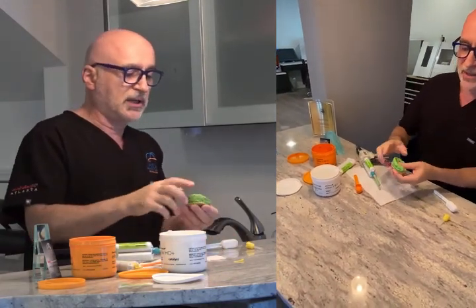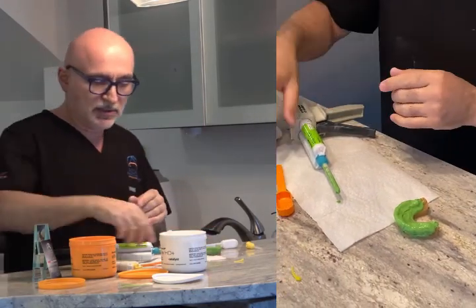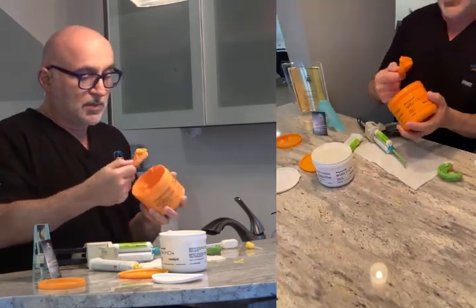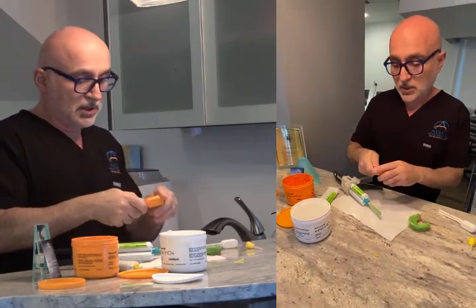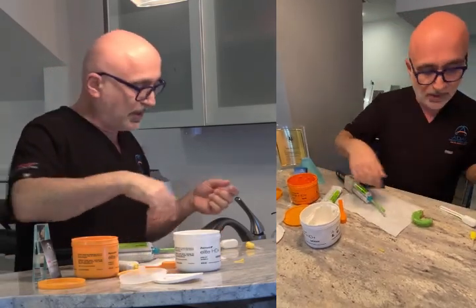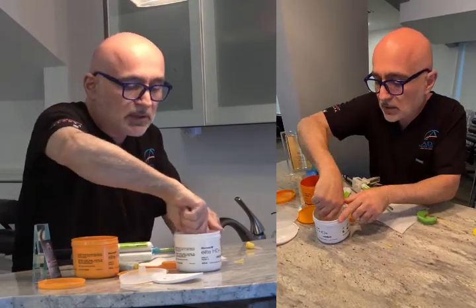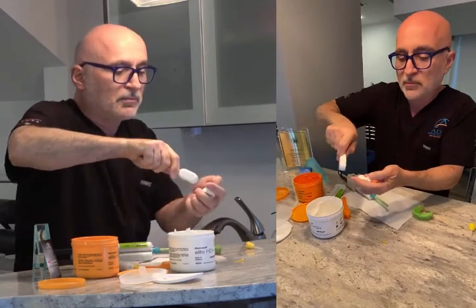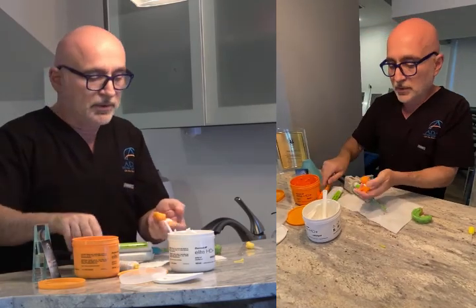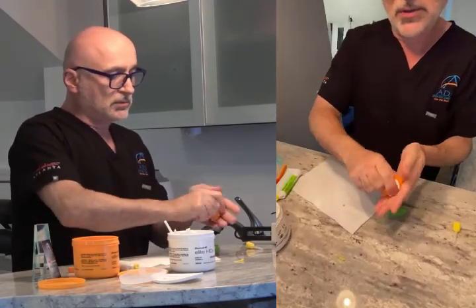The light body is set — you can see it's not tacky. I don't peel it off; I keep it on until I do the hard body, and then it sets together. The reason it's important to have compatible materials is that they don't peel from each other. I've seen many people use two different products that aren't compatible and the light body peels off. So typically one scoop is enough, but to be safe you can add a little extra. Make sure it's about half and half, and mix it really well so you don't have striations.